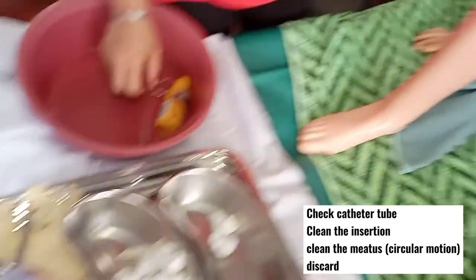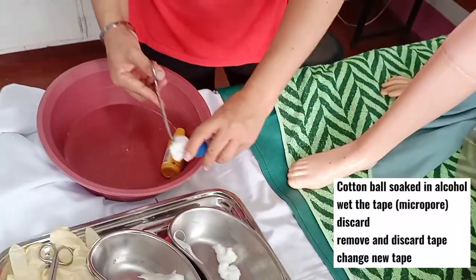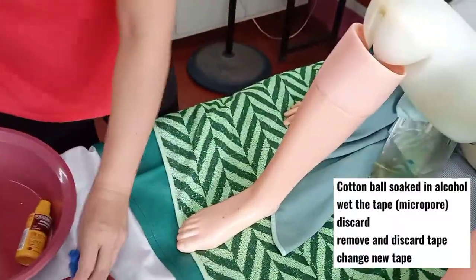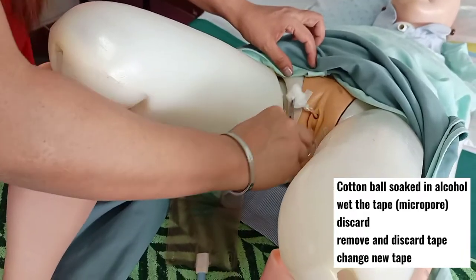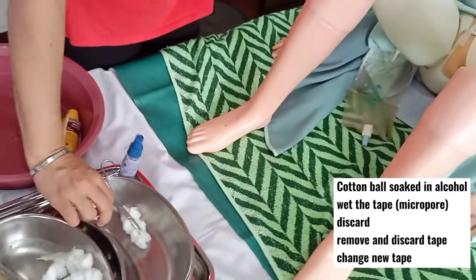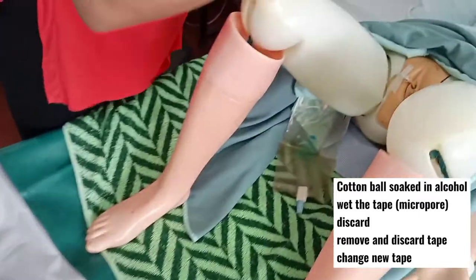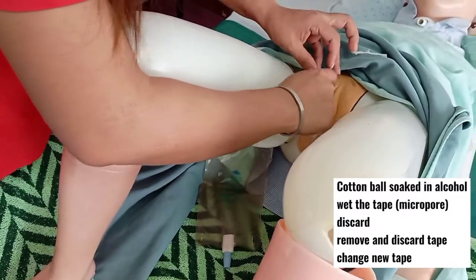Get cotton balls soaked in alcohol to replace the tape. Soak the tape, discard, pull the tape, and change with the new ones.